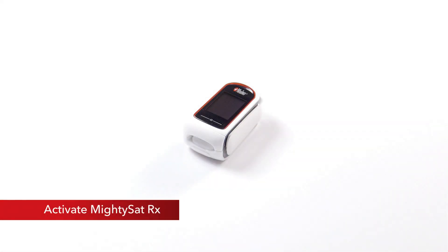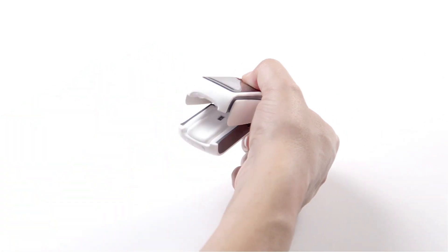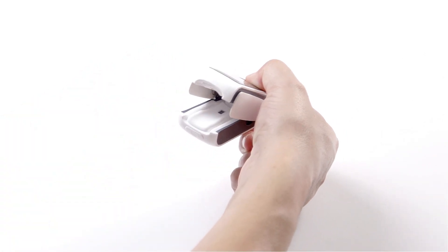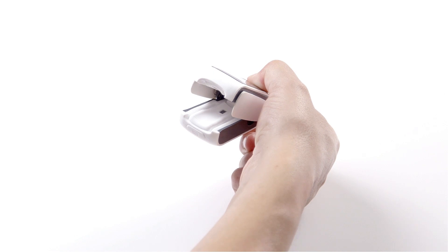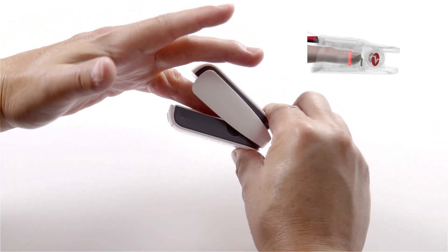To activate and take readings with the MidiSat RX, open the device by simply squeezing the back portion as shown. MidiSat RX will automatically activate when the device is open so that the sensor pads are exposed. Position the finger so that the tip of the finger touches the backstop provided at the end of the sensor pad.